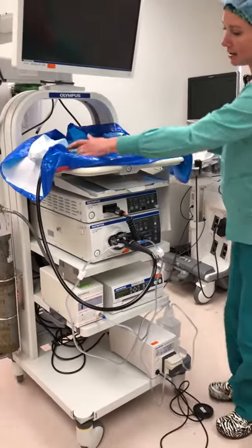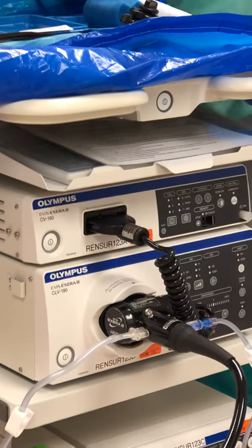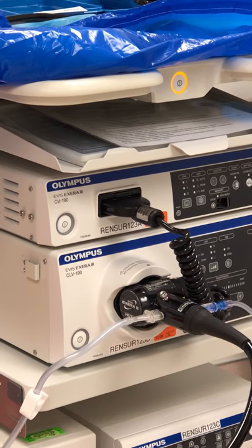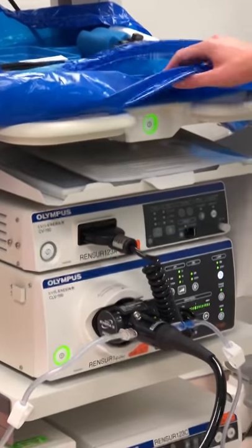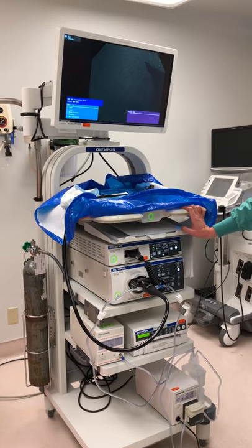The main power switch is right up here at the top. We're going to turn it on, and as you can see everything has come on and is powering up.